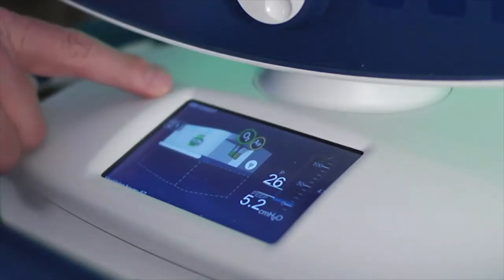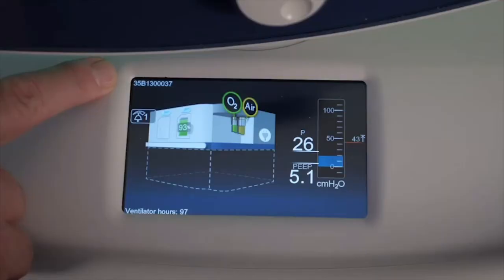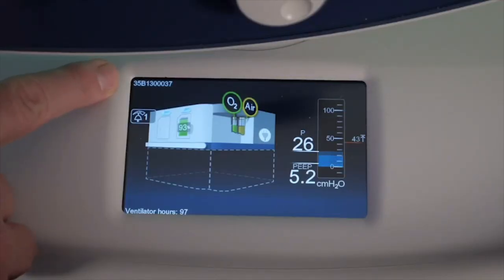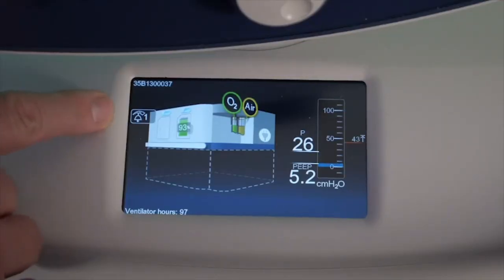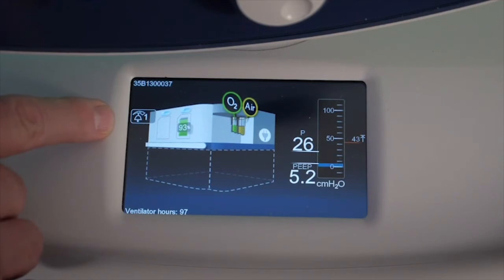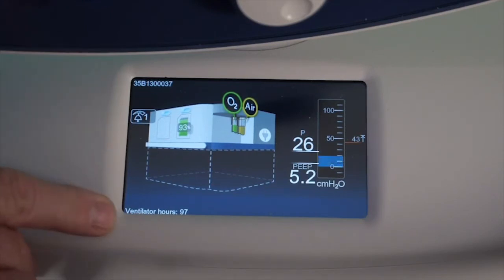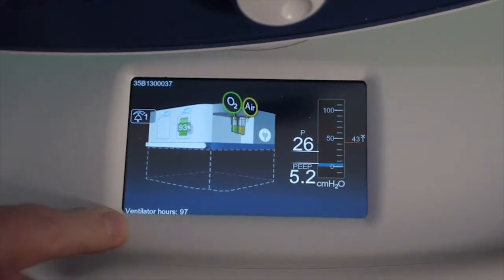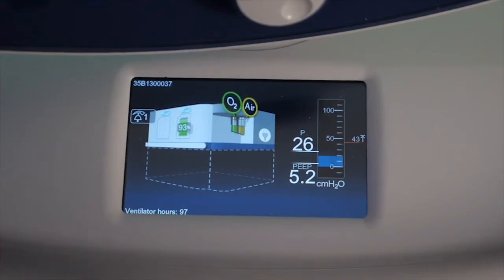Other additional pieces of information: the serial number is up on the top left-hand side, the setting for the alarm volume is shown as well, and the number of ventilator hours is shown on the bottom left-hand side.